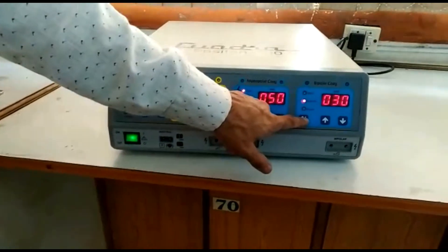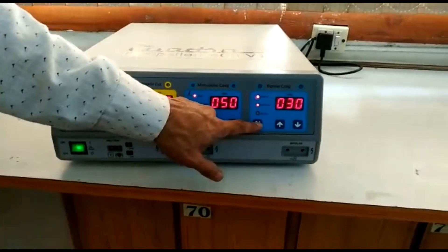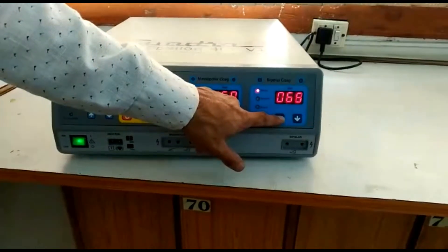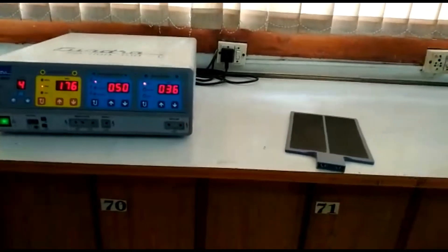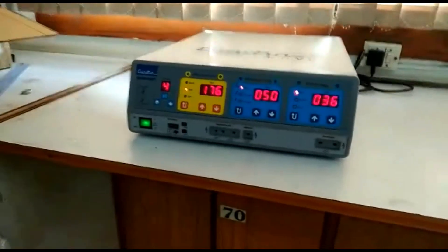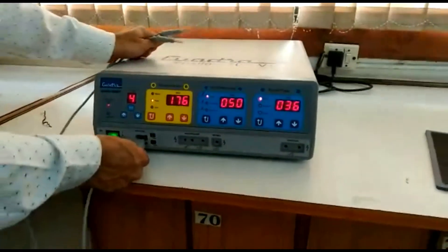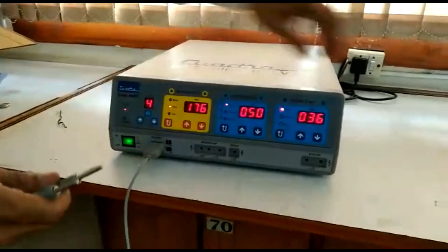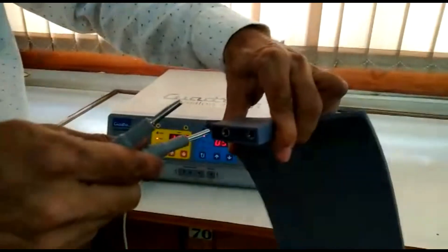Similarly you can change the modes of bipolar coagulation and increase or decrease power using these buttons. The maximum setting for bipolar coagulation is 120 watts. Provided with the machine is the silicon split patient plate. One end of the cable goes into the machine and the other end, which has two pins, connects to the patient plate like this.